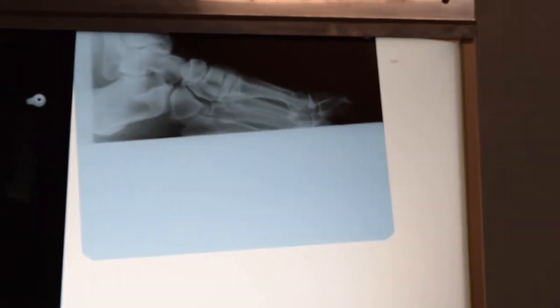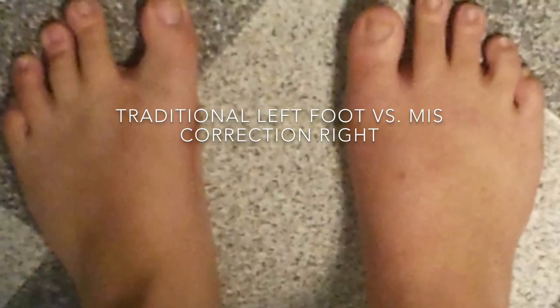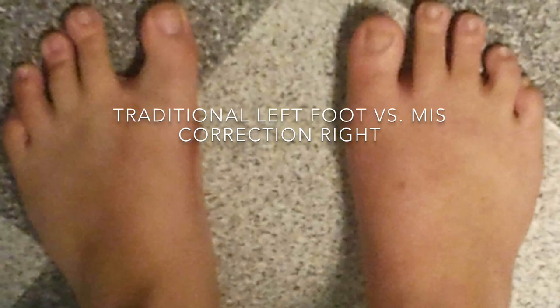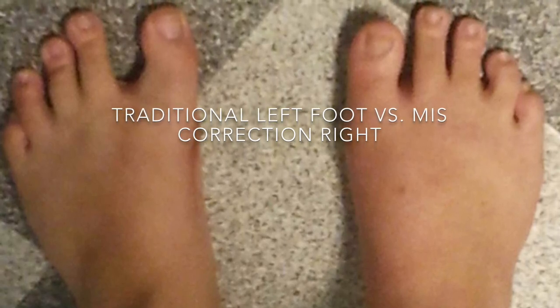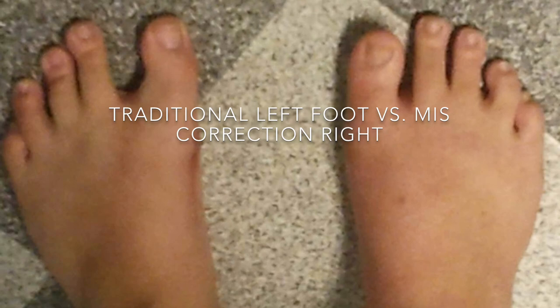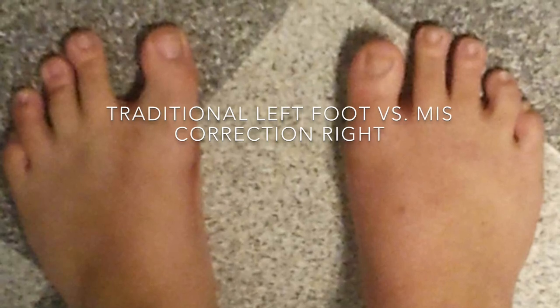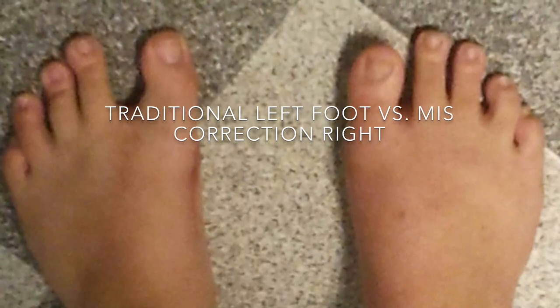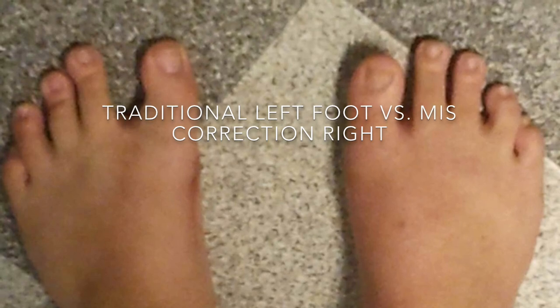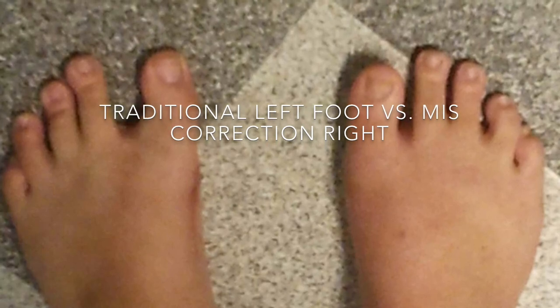So with minimally invasive surgery, here's a photograph I want to show you that shows head to head. If you look at her left foot in our picture here, you can see this foot was done with a traditional procedure by another provider, got a fairly bad varus deformity here, and we performed surgery on the right foot, minimally invasive, and got a good correction. So what we're going to do today, we're going to utilize minimally invasive surgery to correct the Hallux Varus problem she has on the left foot. And we're going to show you a step-by-step process of that. The surgery is fairly simple. It starts with a soft tissue performance of an abductor tenotomy, and then we do a reverse Akin on the Hallux, followed by a reverse Isham Reverdin on the metatarsal.